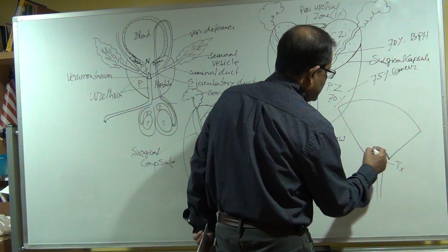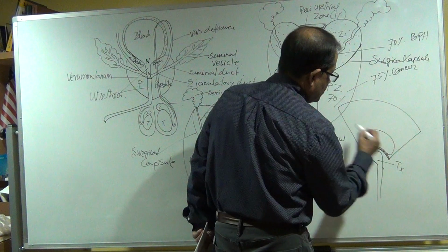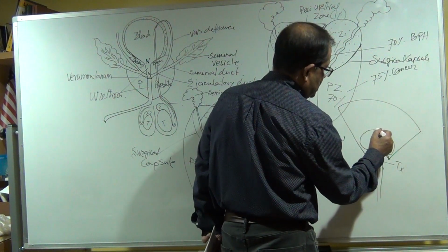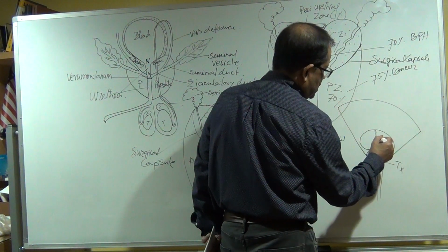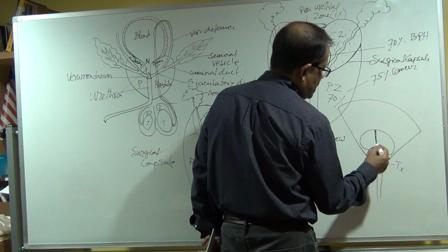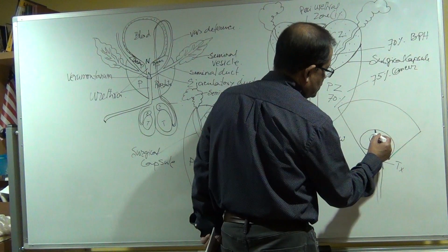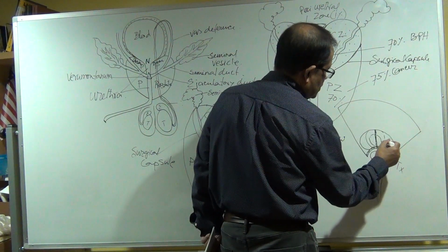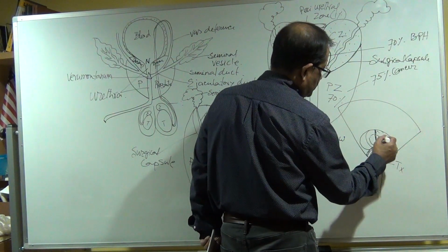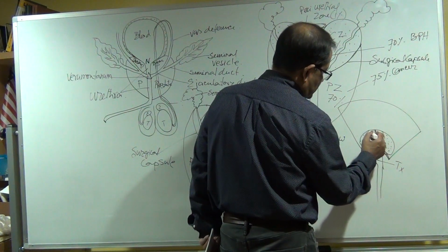So the prostate gland, if you see, you will see the prostate gland like that, and you will see a central hypoechoic layer, that is the urethra, and then you will see the zones.